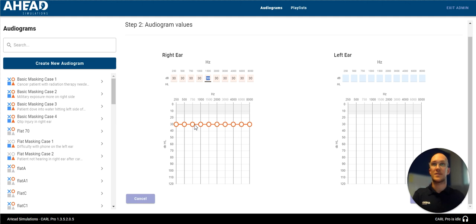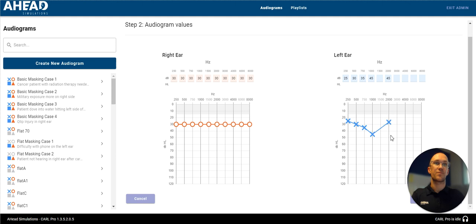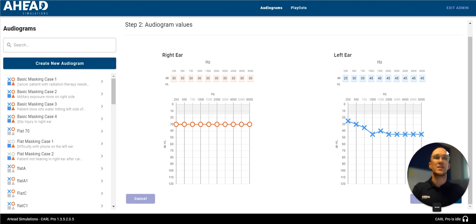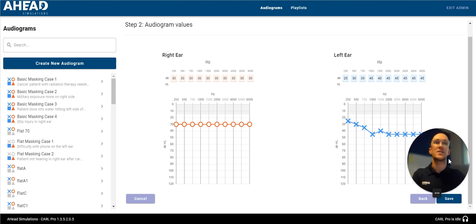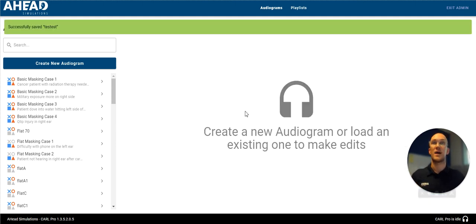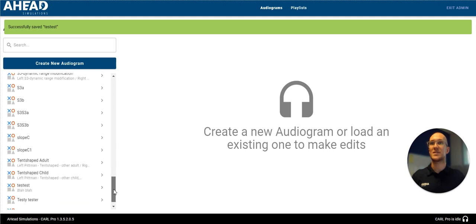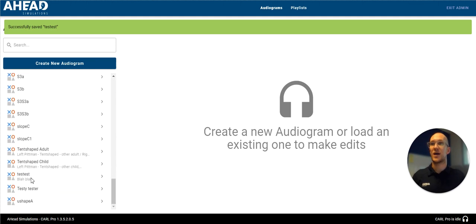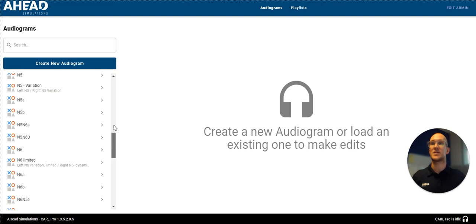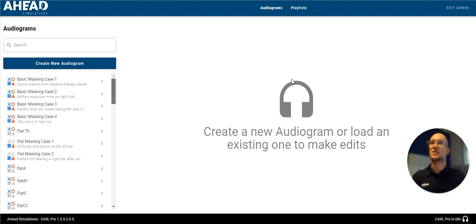Alright, so I just typed all those in the bar. You can also go through and click on the actual graph as well, if that is preferred. And I put in all the octaves and the interoctaves, but you can also just put however many values that you want. I click save, you'll see it successfully saved the test. And when I scroll down, you'll be able to see that in our audiogram list now. So that's number four, creating your own audiogram.